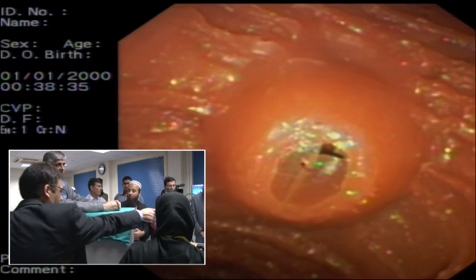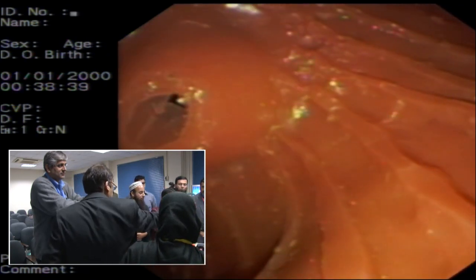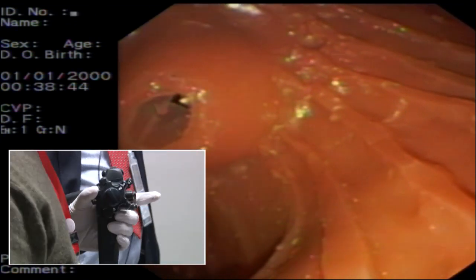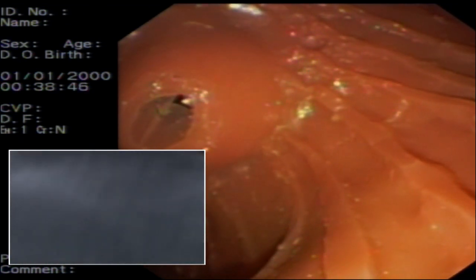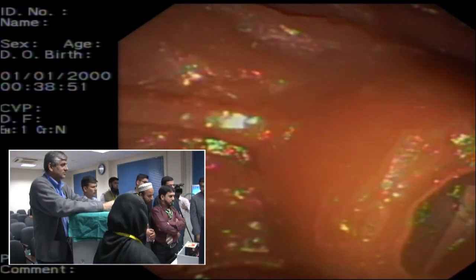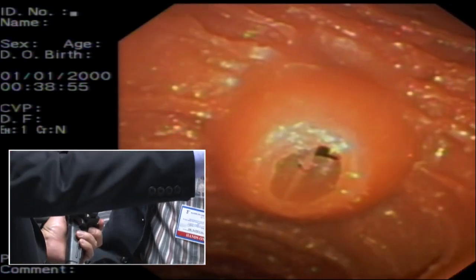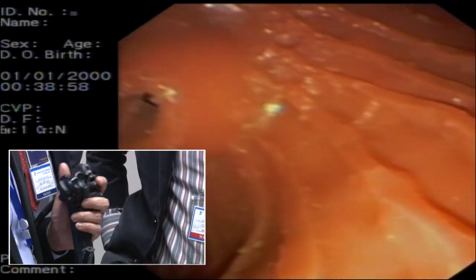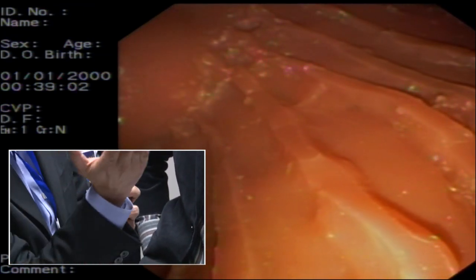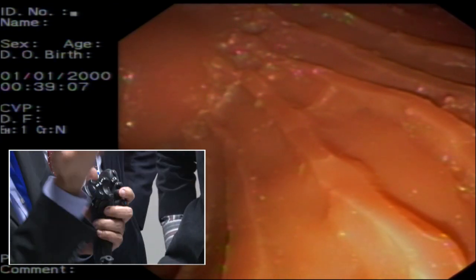I think this is the wrong position of the scope for ERCP. It has to be located a little bit to the side. It has to be like here, with one holding it, and I'm in here. This is not the position for ERCP. It has to be changed a little. Look at the movement. It will give you a movement too. But if your scope is like this a little bit, it kind of just hugs on to the apex. So it doesn't fall back.